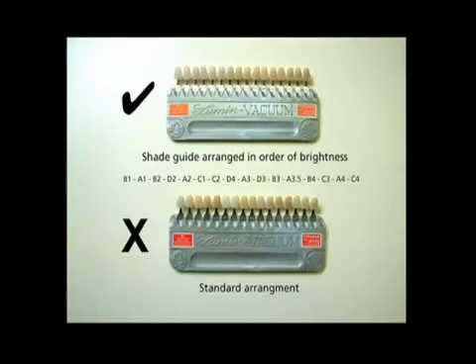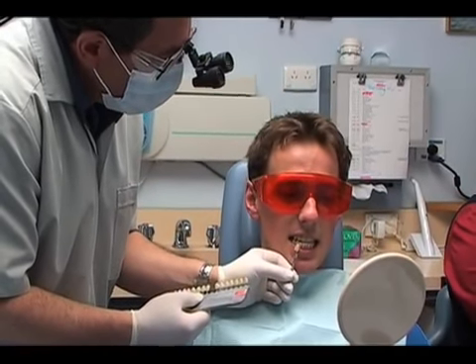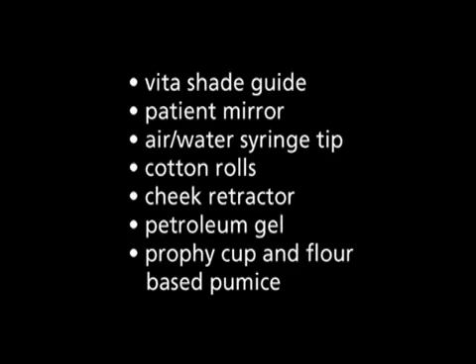With the patient, determine and record the pre-whitening shade of the teeth using a Vita shade guide in order of brightness as opposed to the standard arrangement. We recommend at this stage a before photo be taken. This will provide a starting shade reference to be compared to the post-operative shade.